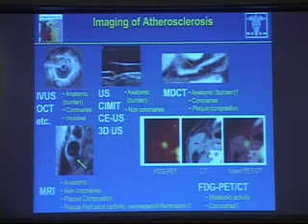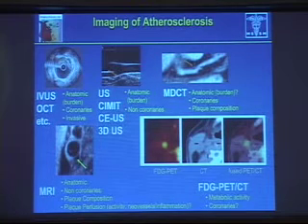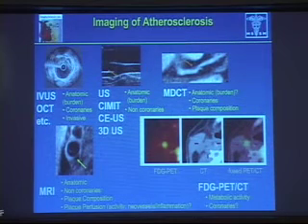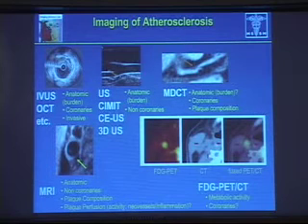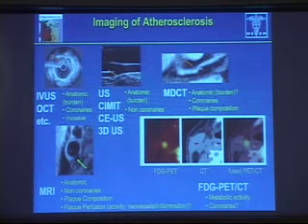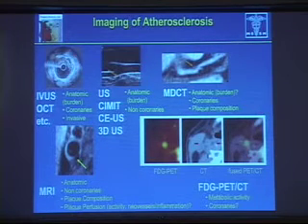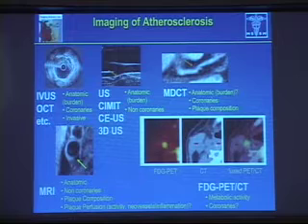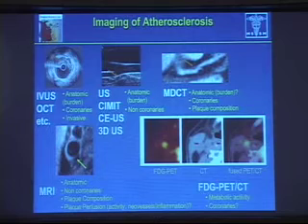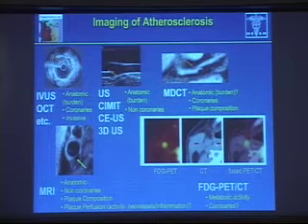Magnetic resonance imaging continues to be here because of the non-invasiveness, the lack of radiation, as well as the manipulation. MRI is very rich, there are a lot of knobs, and maybe that excites people, but also turns people off. There's a famous Nobel Prize winner who said, if you treat the spins very well, you can let them do whatever you want. We have John Pauly here, who is a master spin manipulator, from a good point of view, not a bad point of view. And I will talk a little bit about taking MRI beyond, and I think Jonathan will obviously stress this more. I'll talk about perfusion-type measurement where you can look at perfusion of tissue activity.